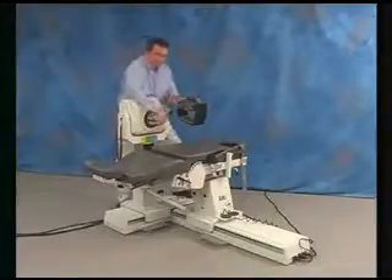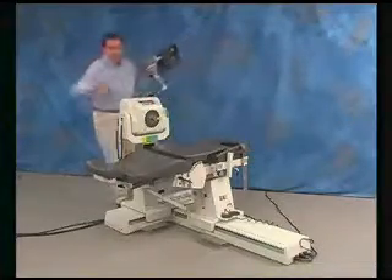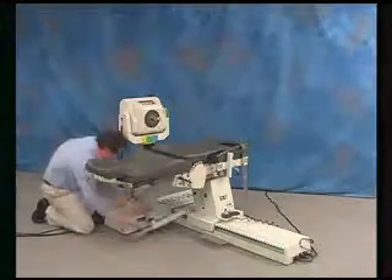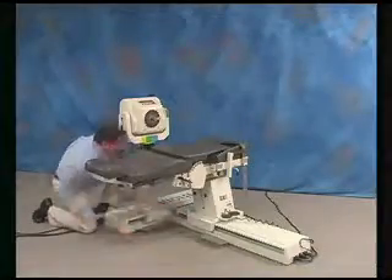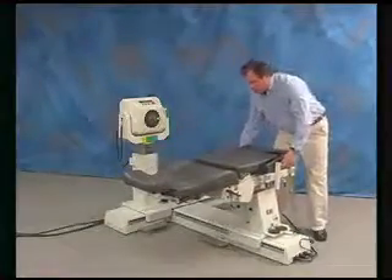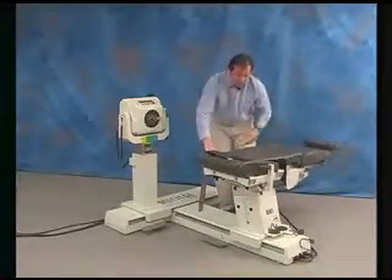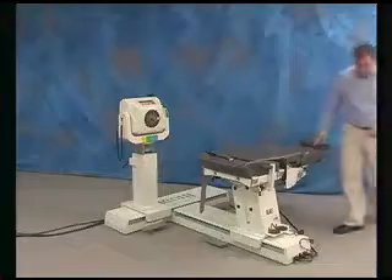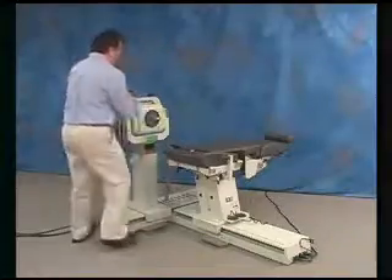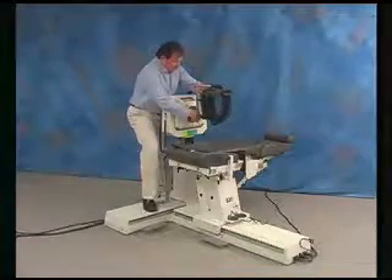To switch to the opposite side, first you need to remove the hip attachment. Then remove the chair stabilization bar. Slide the chair away from the dynamometer and rotate to the opposite side zero degree position. Return the chair to its previous placement on the T-base and reattach the chair stabilization bar. Now you can reconnect the opposite side hip attachment.